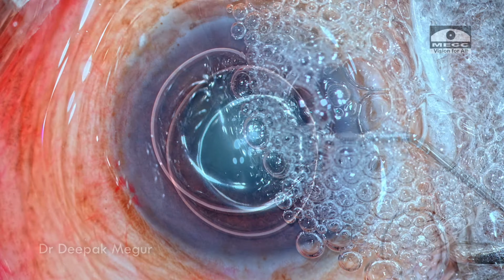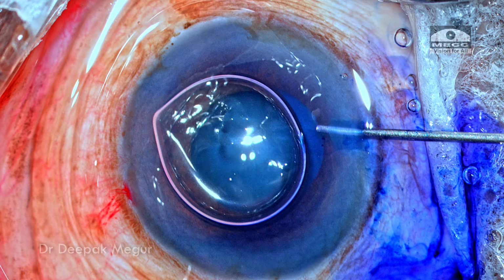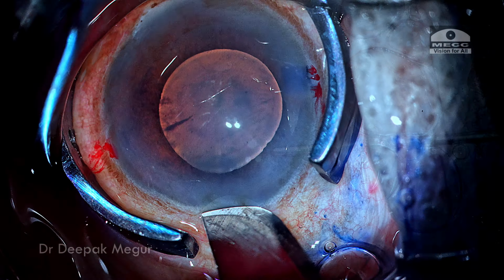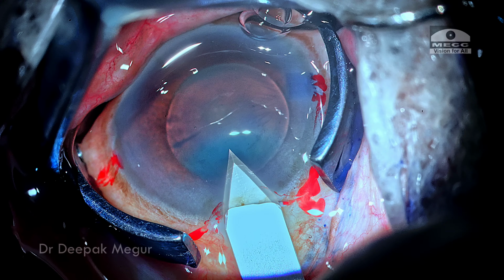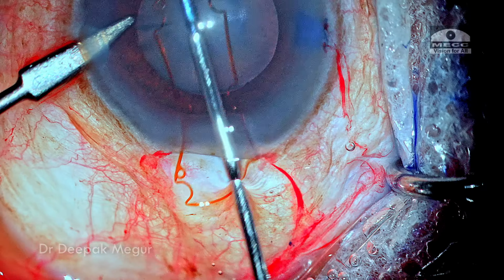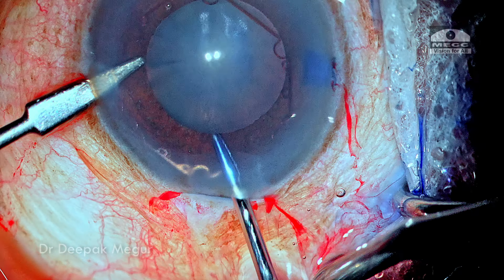The incisions are created. The eye is filled with viscoelastic. And expecting an intraoperative miosis, or to deal with any intraoperative surprises, I'm going to use a pupil expansion device, that's a B-Hex ring, just to be on the safer side.